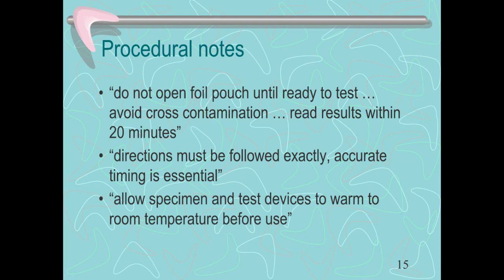Procedural notes. Don't open the foil pouches until you're ready to test. Avoid cross-contamination. Read the results in 20 minutes. So those are all things you have to be aware of. Directions must be followed exactly, and accurate timing is essential. If you leave it in too long or too short, your results aren't going to be correct.